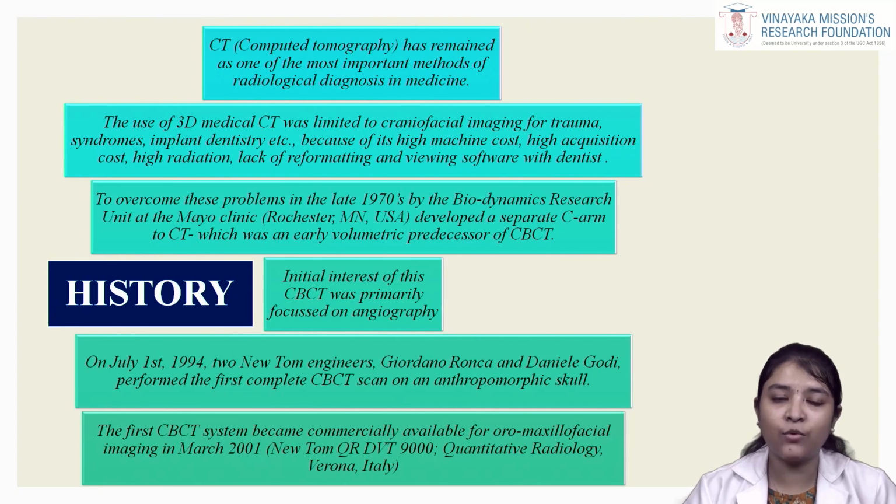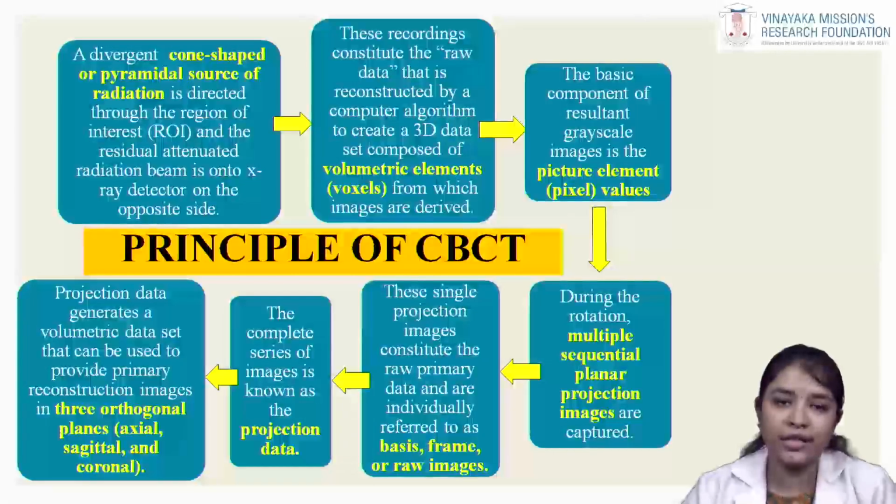Then CBCT was initially used as an angiograph. In 1994, it was used only in the skull region, and it was the first time for examining a skull region. Then in March 2001, it became commercially available for radiographic diagnosis in oral and maxillofacial structures. The principle of CBCT.